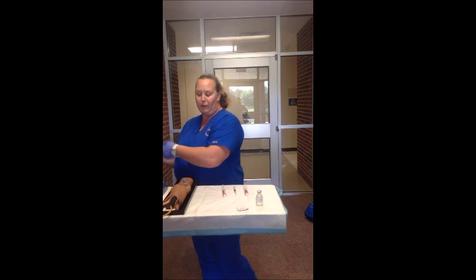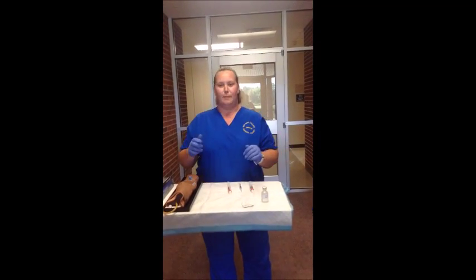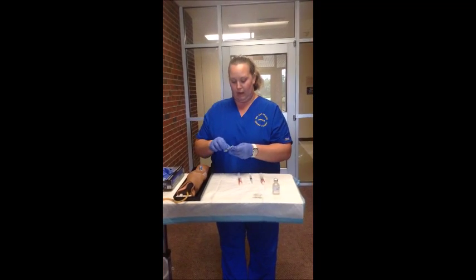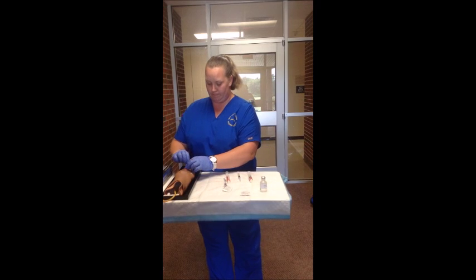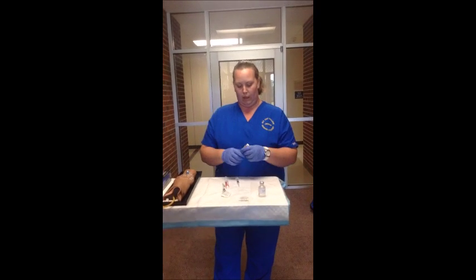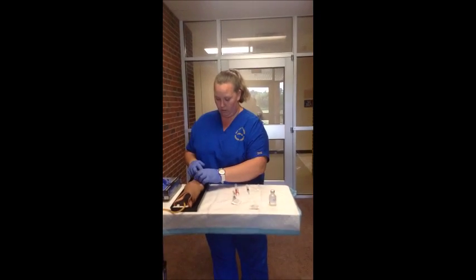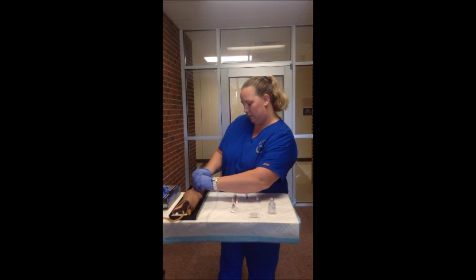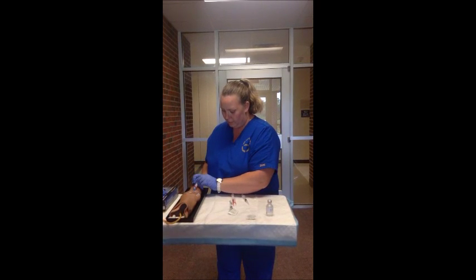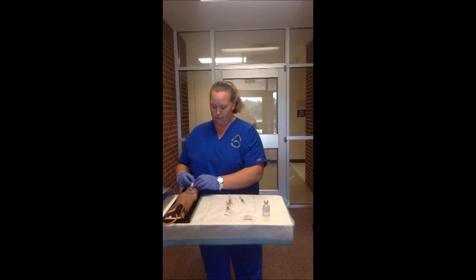I will remove my gloves, perform hand hygiene, and go ahead and do this all over again, but for time's sake, we're not going to do that. So then I'm going to scrub the hub, and I will take my saline and get it set up here and retract for blood return to make sure that there's good IV placement, which there is, and then inject the saline.